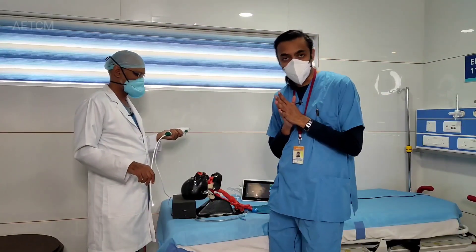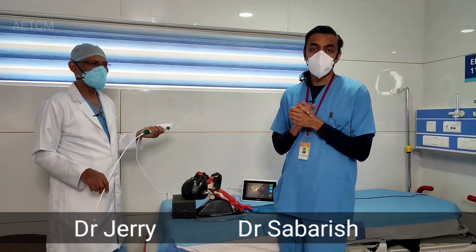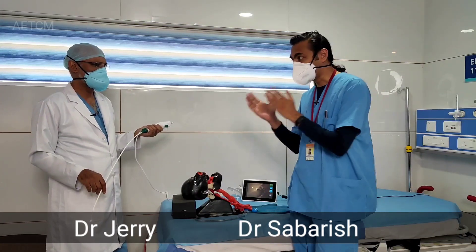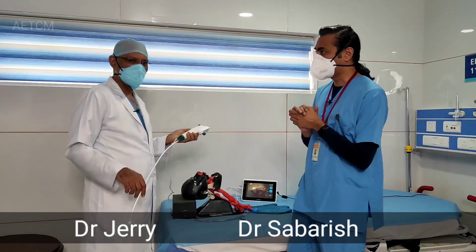Hi, welcome to AATCM YouTube channel. Today we will introduce an equipment that is a flexible bronchoscope. With me I have Dr. Jarissa, Professor in Anaesthesia. Can you just introduce the parts of this equipment?